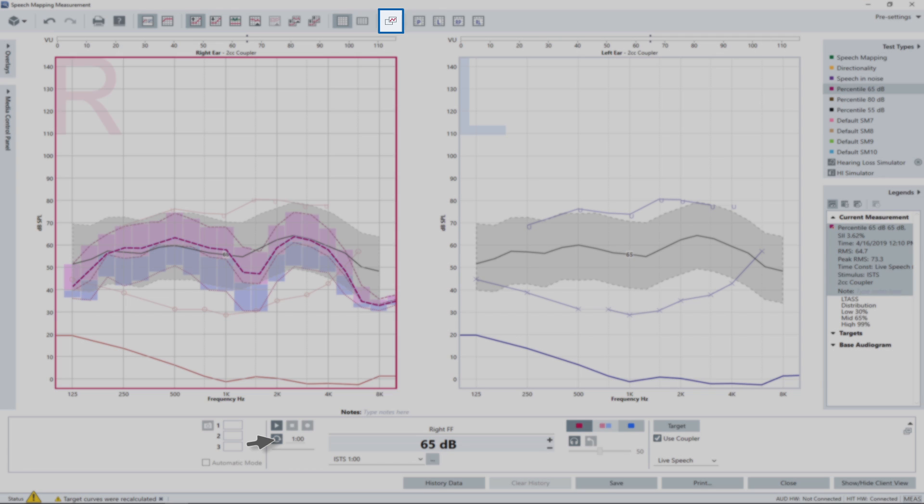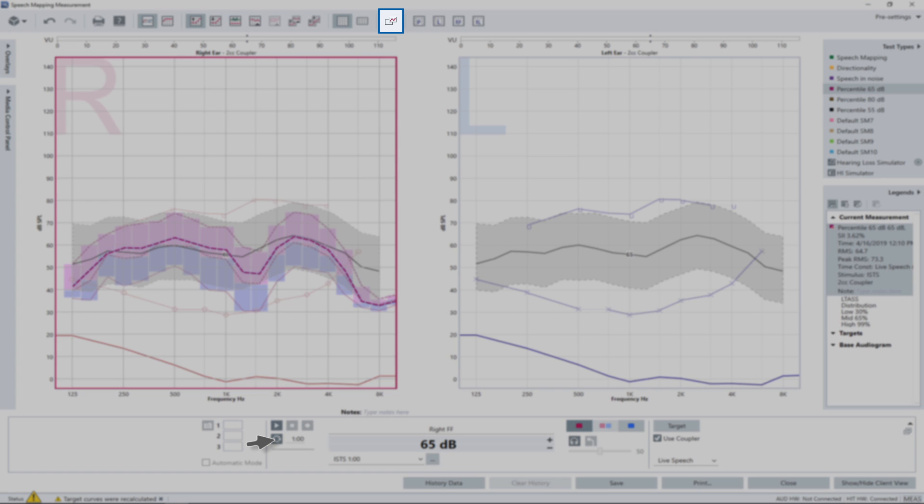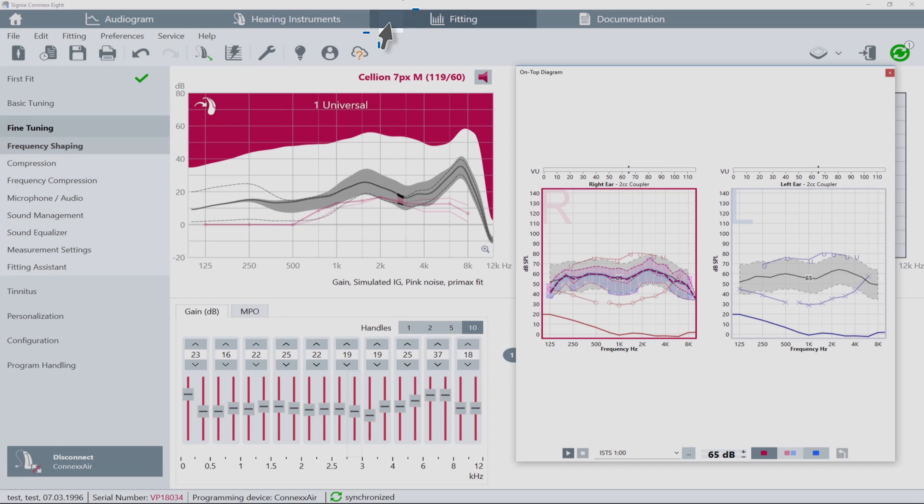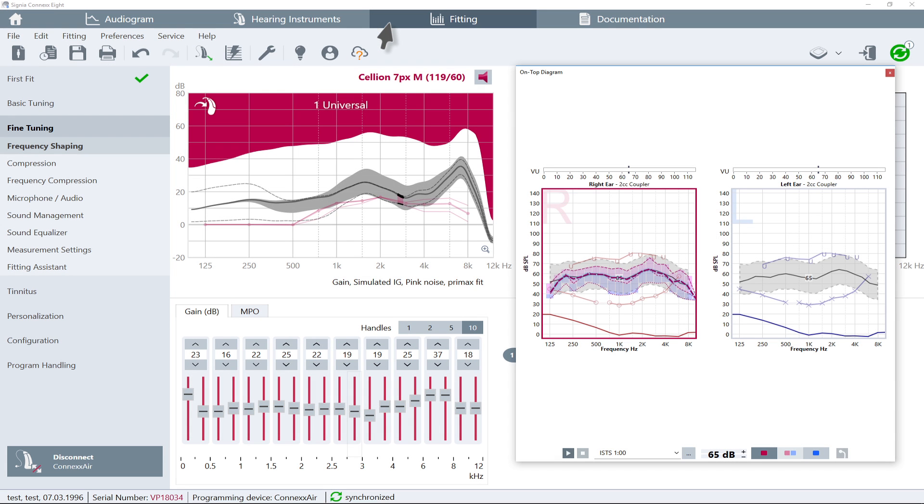Click on the on-top mode icon to minimize the measurement screen and overlay it on the fitting application window.